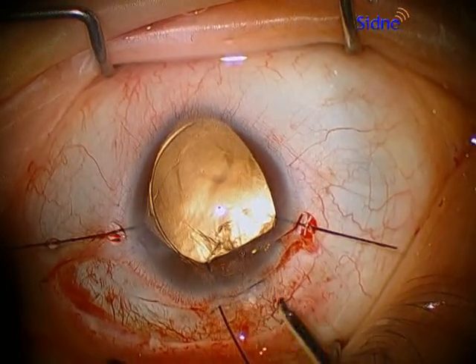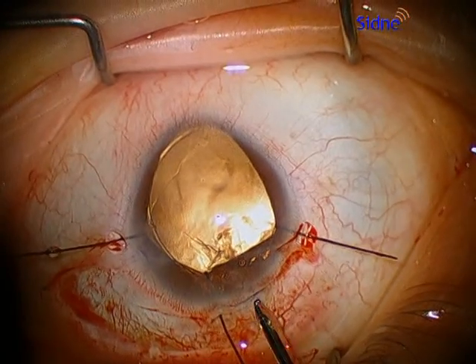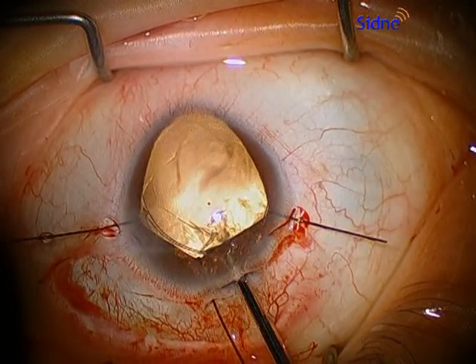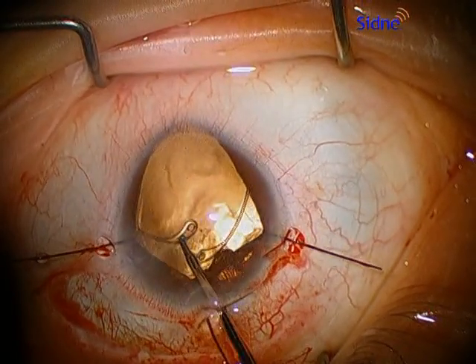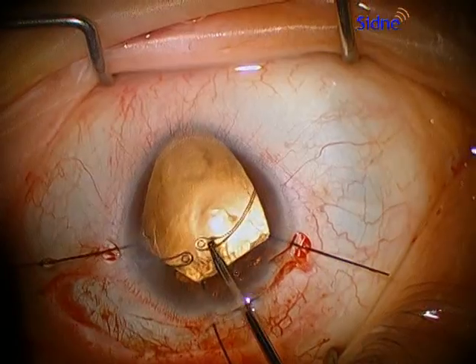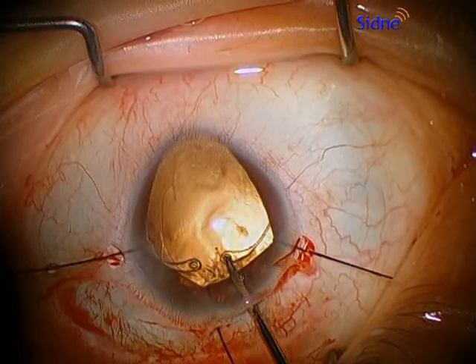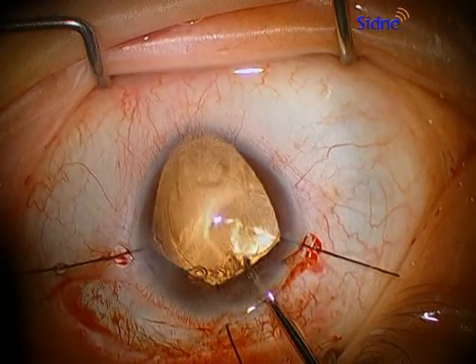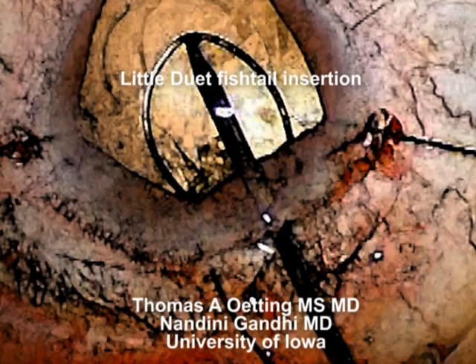This is a nice technique when you have a bag which is very very loose, such as in this case where we had a significant coloboma inferiorly which led to significant zonular weakness. Then just use the duet forceps to continue to place the capsular tension ring in place. This is a nice technique to have in mind when you have very loose zonules.